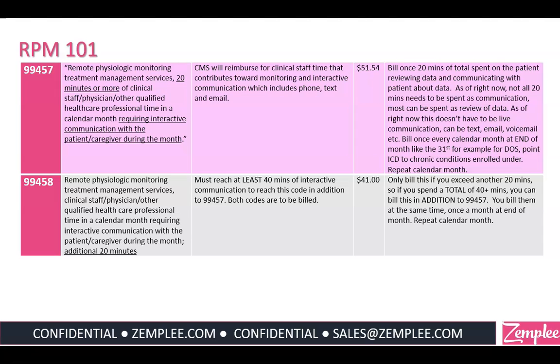This needs to be documented in the record, either in the RPM system that can be retrieved or in the EMR itself, but the task needs to be documented. So the MA would log in and say, performed 10 minutes of chart review, saw data showing trends in elevated blood pressure, notified patient to come in for a new visit, and notified physician of elevated blood pressure trends, and we'll deal with it during the next encounter. Something like that.